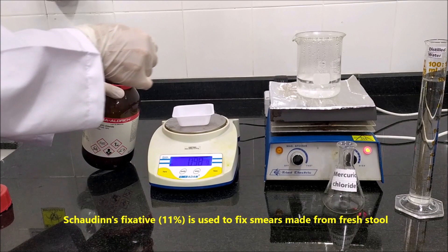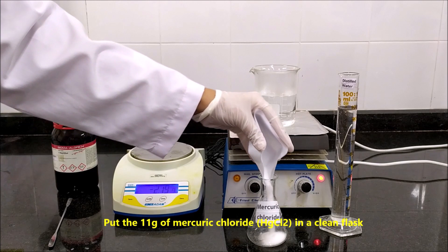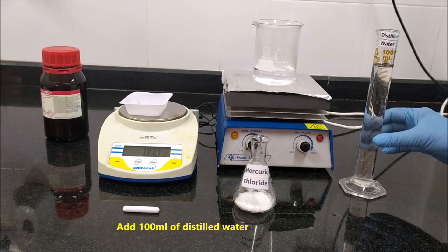Preparation of Chauden's fixative for fresh fecal smears. Chauden's fixative 11% is used to fix smears made from fresh stool. To prepare 100 ml of Chauden's fixative, weigh 11 grams of mercury chloride, a very toxic powder. Put the 11 grams of mercury chloride in a clean flask.